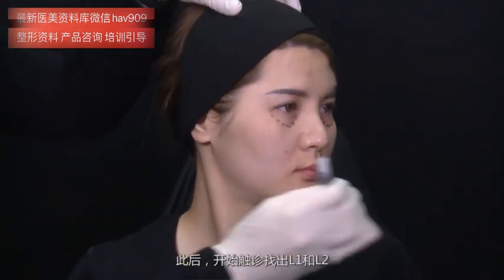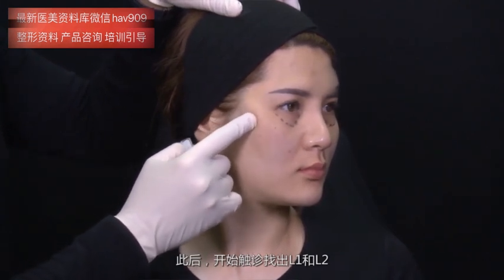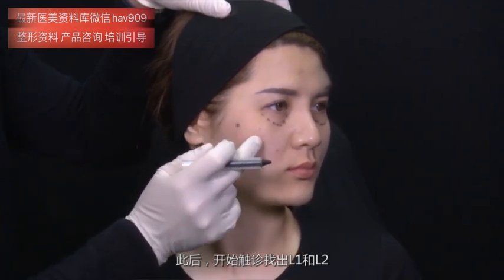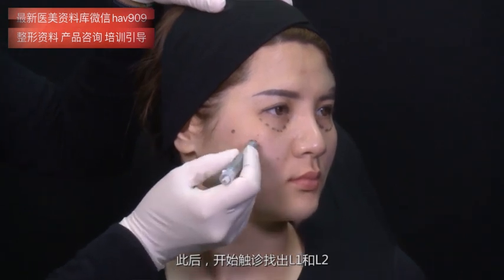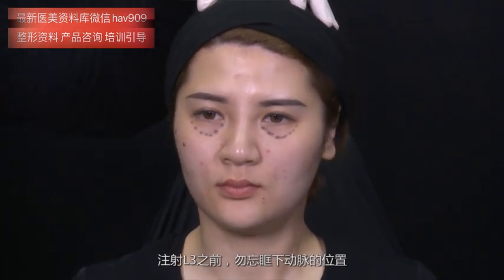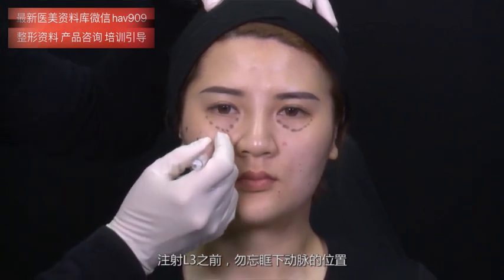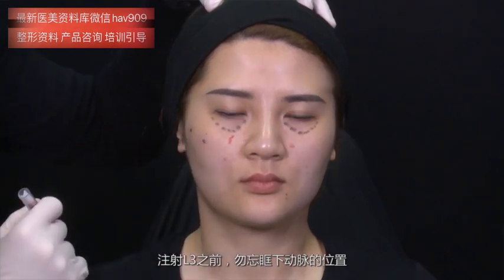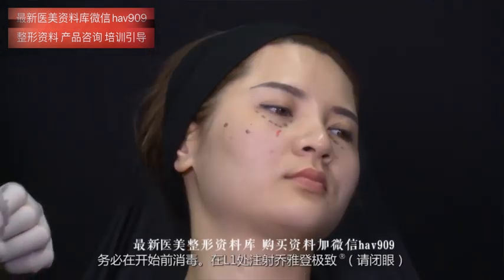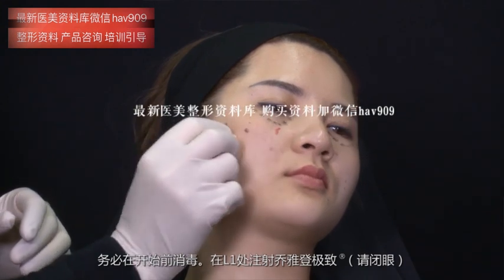After this is the time that we palpate L1, and L2. Never forget that before injecting L3, I have to remember the position of the infraorbital artery. Now, before starting, antisepsis is mandatory.